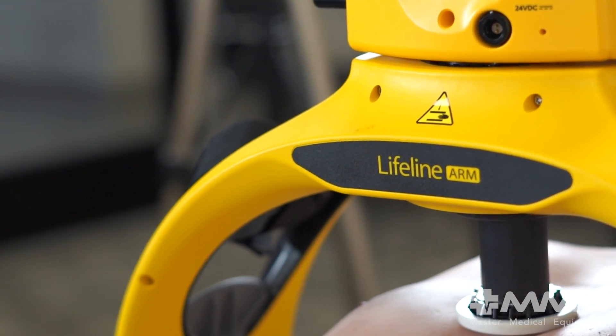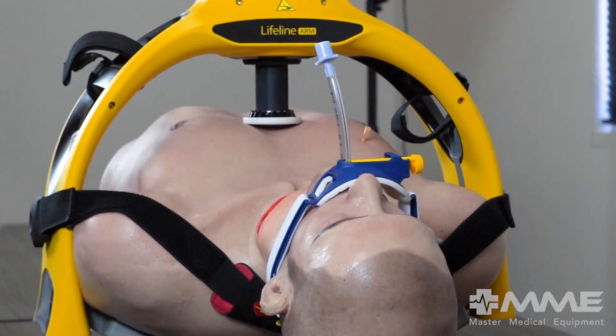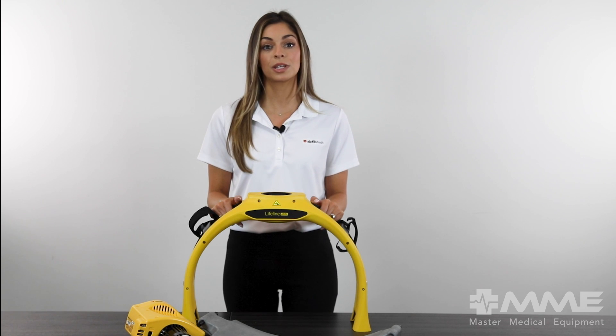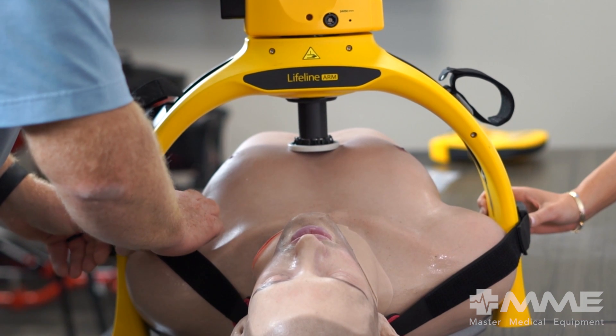The arm is the result of years of EMS-based transport studies. DeFibTech has carefully crafted the ergonomics of the arm and backboard to make transport smooth and straightforward, even with a patient on the stretcher. Its lightweight design helps transport from the ambulance to patient even faster.